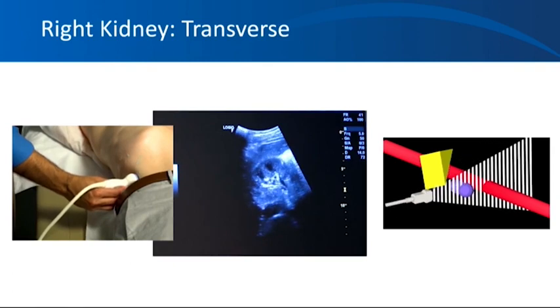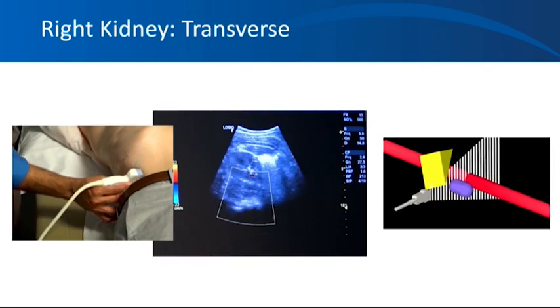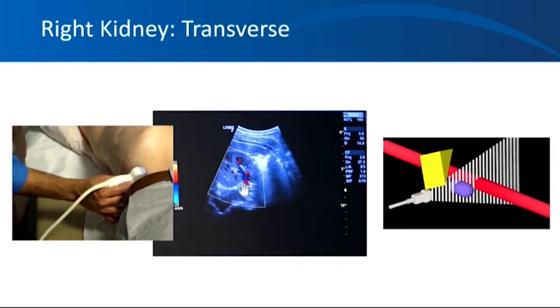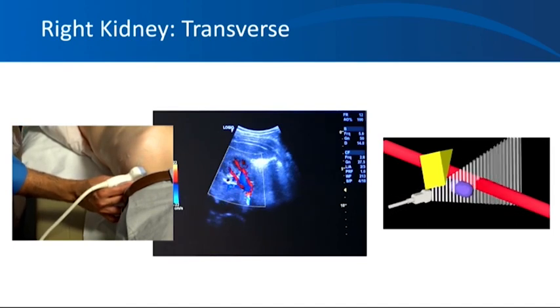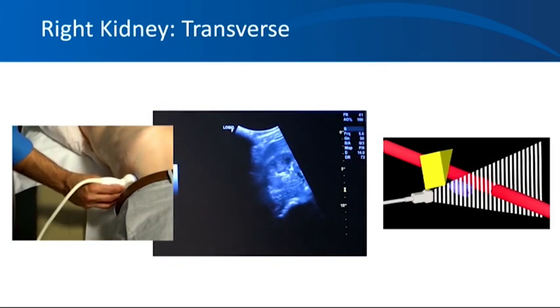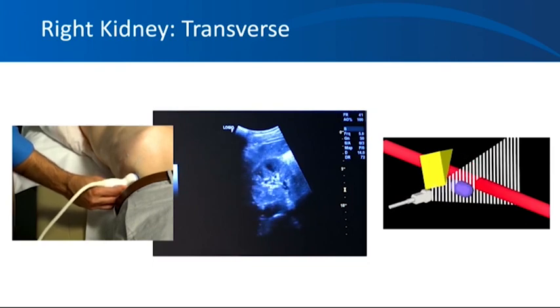Taking a deep breath and holding will give a better view if the patient is able to cooperate. The transducer is then swept up and down to view both upper and lower poles. The mid pole of the kidney is C-shaped due to structures entering and leaving the kidney, as you can see in this Doppler picture. As you go towards both ends they become circular. You can see the sweeping movements showing the C-shaped mid pole, and as you go towards up and down, the kidney becomes circular in the transverse view.